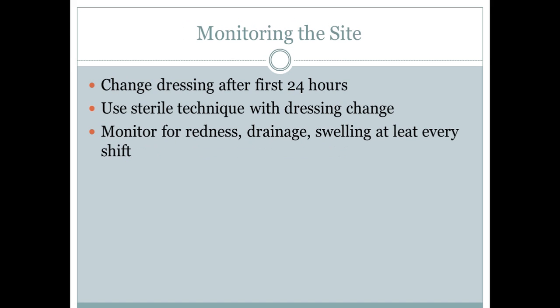dressing after the first 24 hours. And it is going to be like a Tegaderm, a transparent dressing, so you'll be able to visualize the site. We'll talk about some other things in the skills lab, as far as using, and I cannot remember the correct term for it, but almost like the little antibacterial or antifungal discs that they'll put underneath the dressing changes. You'll see them with a little cutout, almost like I think of tracheostomy or other dressings, where they have the cutout that can wrap around where the insertion site is, where the tubing comes out. So we'll be talking about that.